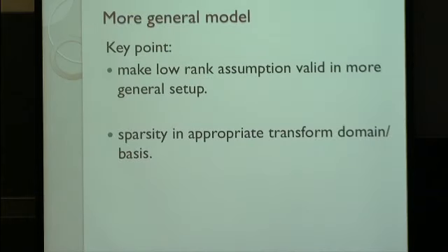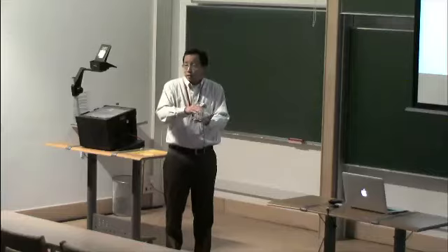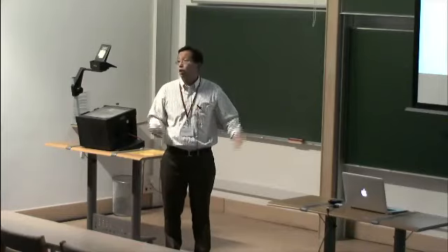Okay, so again, the question is the main things about the practicality of this model. There are two things: low rank, a big assumption, and sparsity. Low rank is not a bad thing, but if you put all the images in pixel by pixel, aligned just that way, any little shift, any little dilation, translation, or even intensity change could cause it to not be low rank.